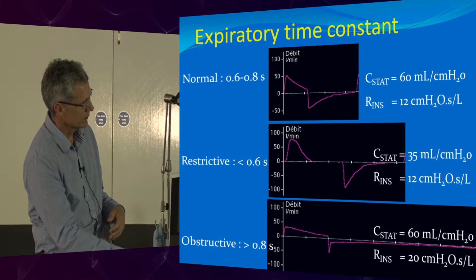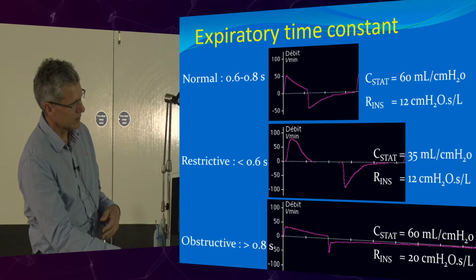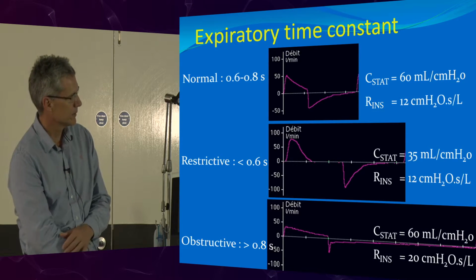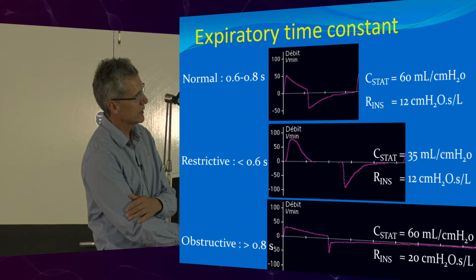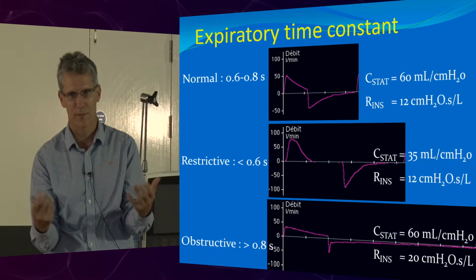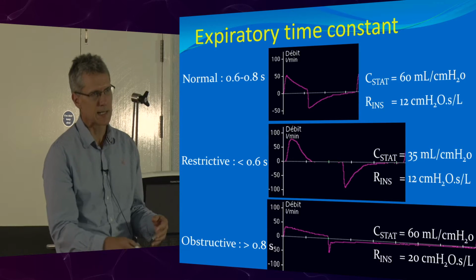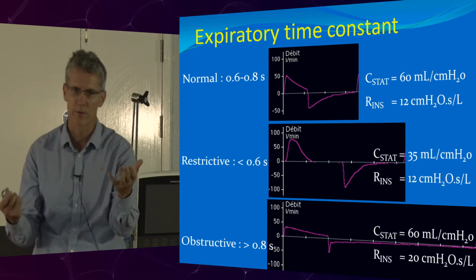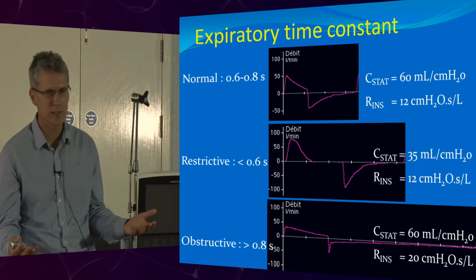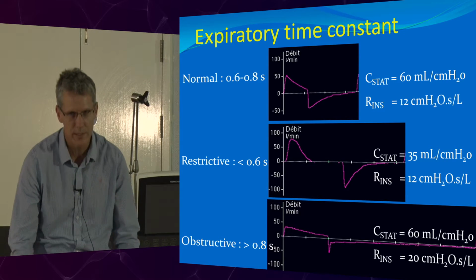And then if you look at the COPD patient, you see the flow rates are a lot lower, but they take a long time to breathe out, yeah? So compliance normal, the resistance is up, okay? The area under here is all the same, as if you're breathing out 500 mils. But the thing which will change, with COPD or asthma, you classically have a lower flow rate. We know this from peak flows. But it takes a lot longer for them to breathe out. So clinically, you see these guys lean forward and they're breathing out like this.